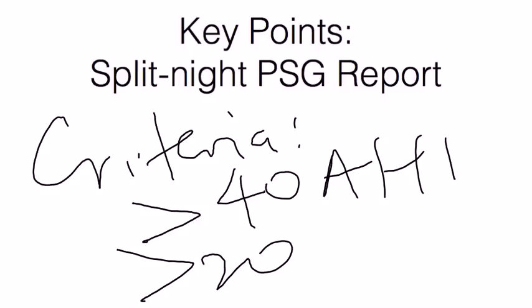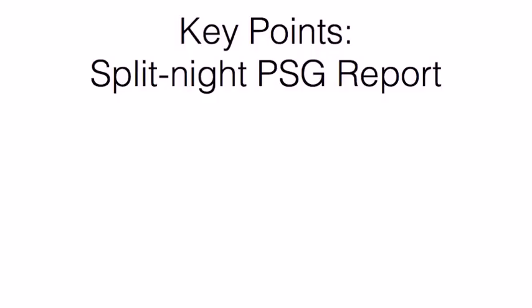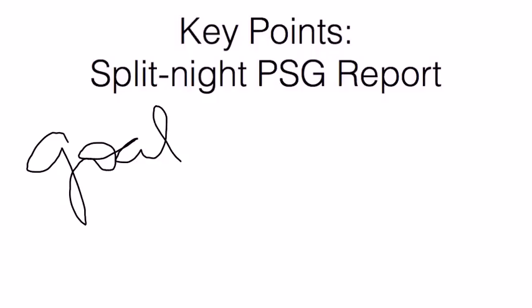But in most sleep labs, if there's any doubt about the criteria or even whether they've reached that minimum amount, the idea is to continue just for a full night if there's any doubt about whether the patient has met criteria or not. Now the goals of the split night is to assess for CPAP titration adequacy or optimal pressures.